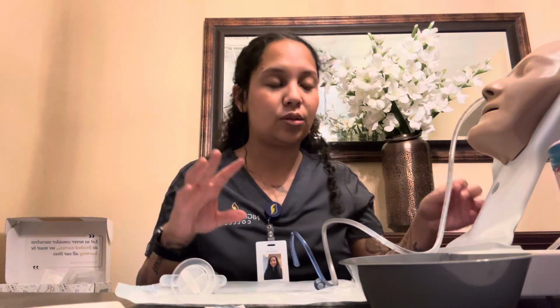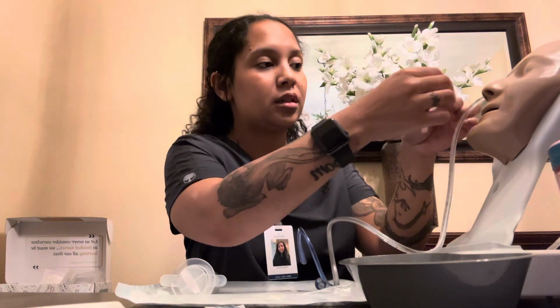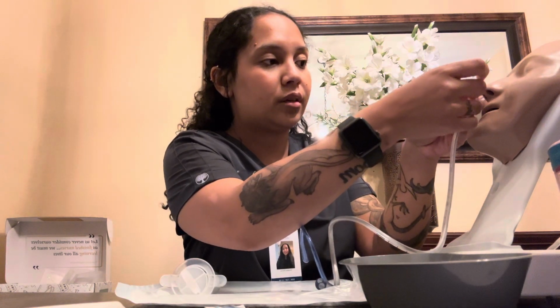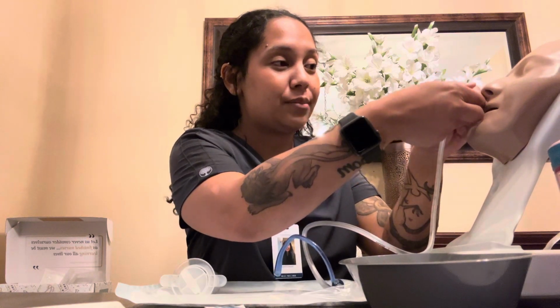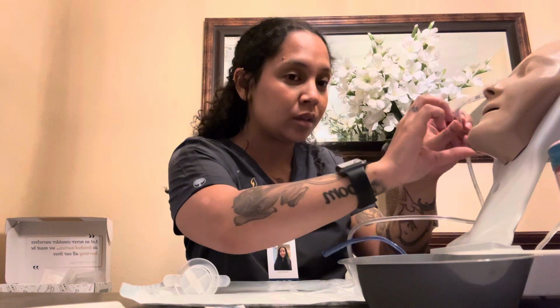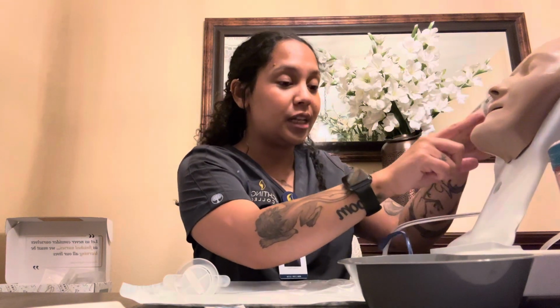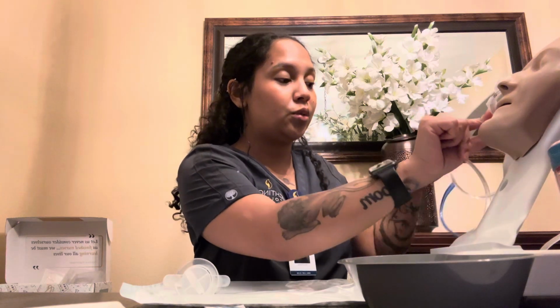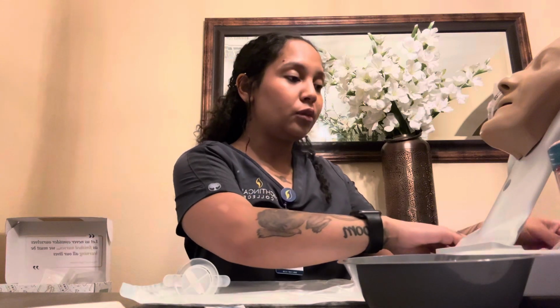So okay, cool. Make sure she's comfortable. I'm gonna go ahead and tape this. At my facility, I'm really not used to doing this pants method, but we have a special thing for the NG tubes that go on the cheek, because I actually work with kids. We would place this comfortably along the side of her face, and then make sure to tie it to the gown. We could use a little pin or whatever works to keep it out of her way.